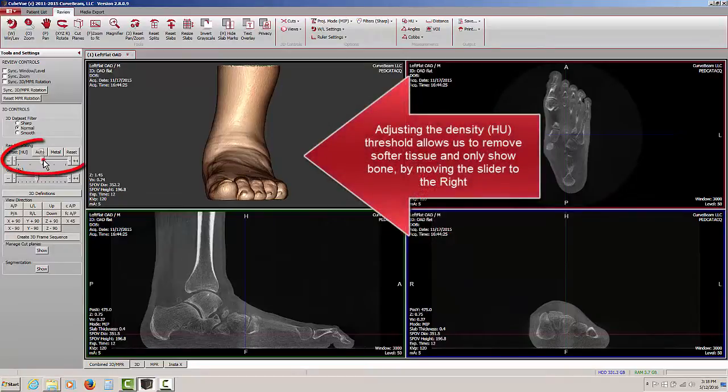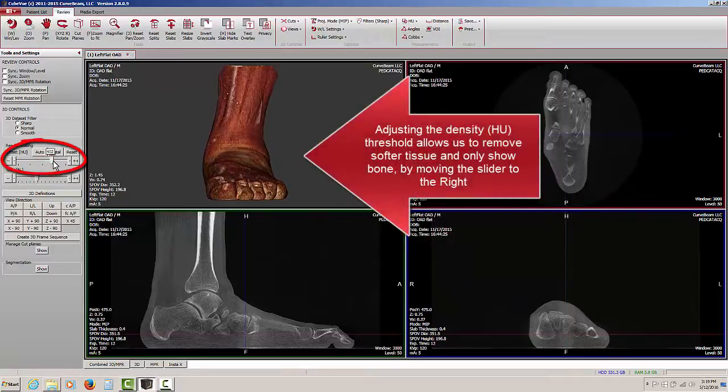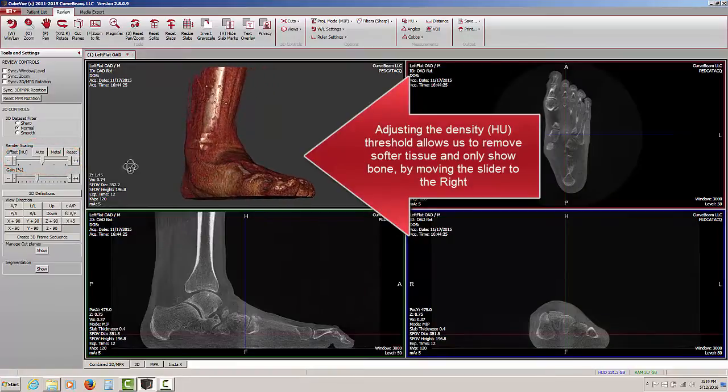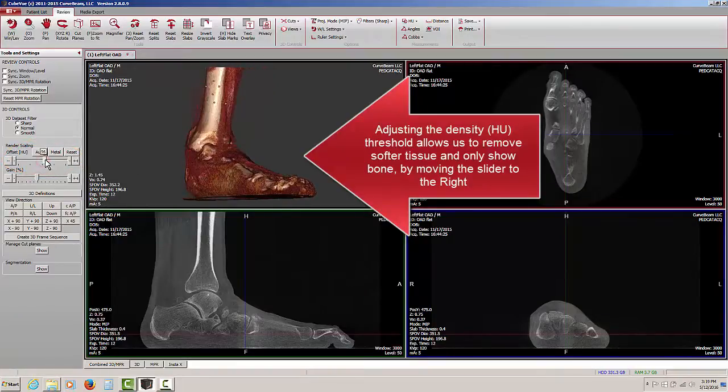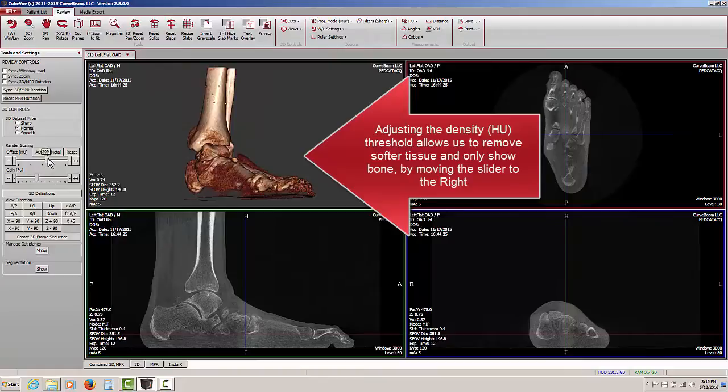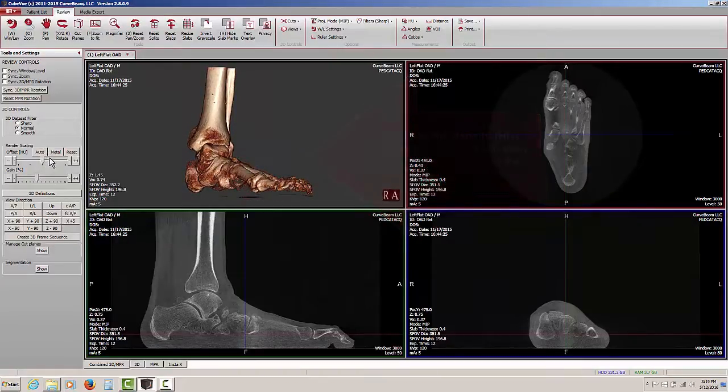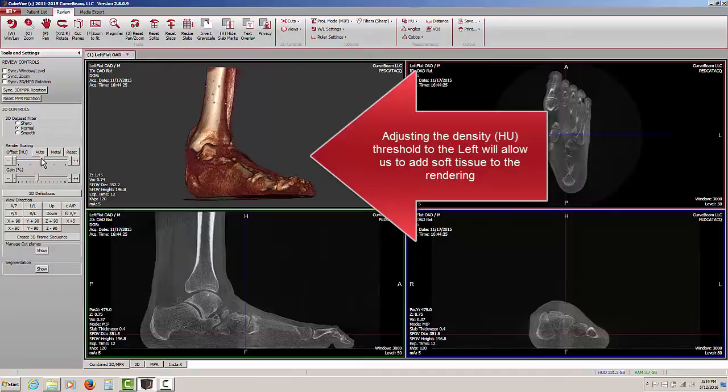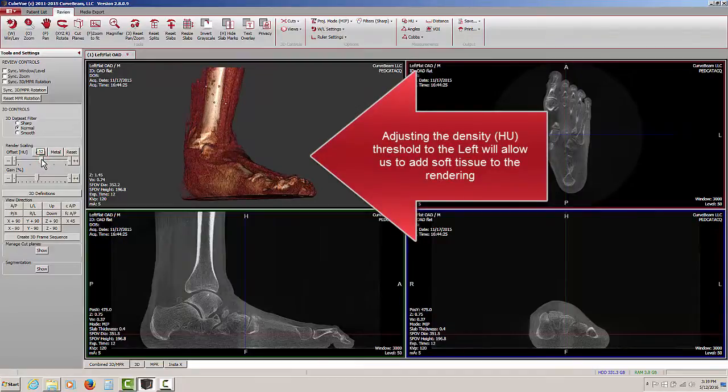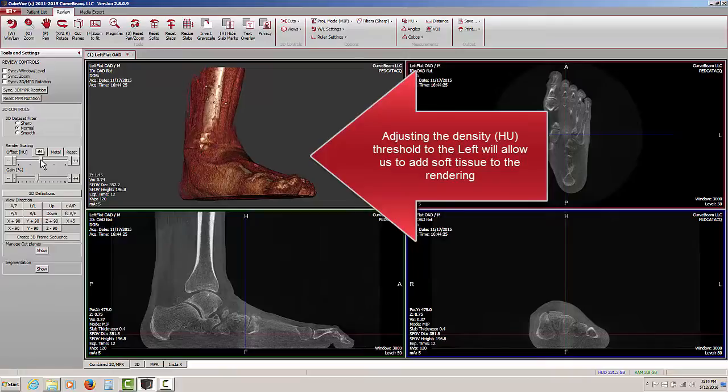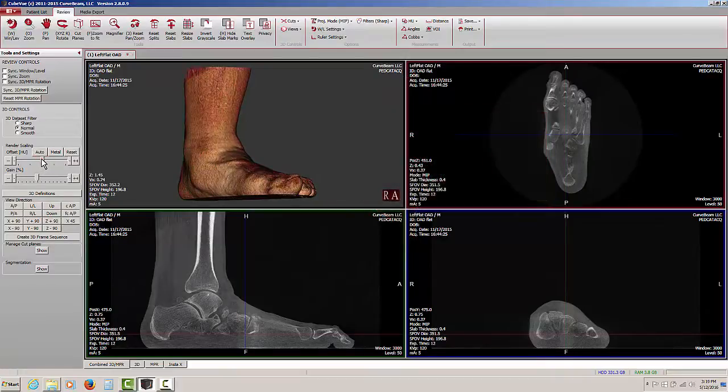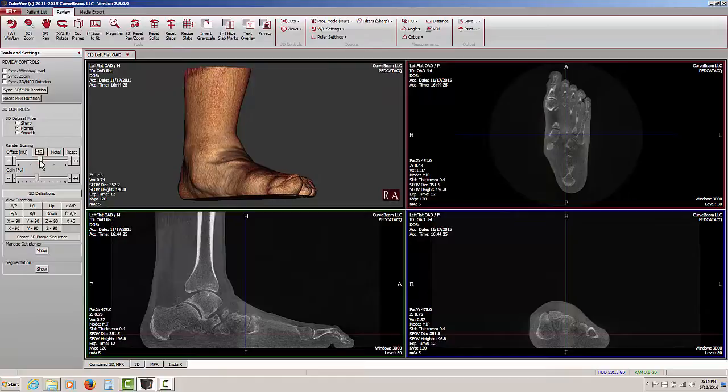By adjusting the slider, we can remove softer tissue, in this case skin, subcutaneous fat, and as we continue to adjust the sliding scale, we are presented with the more dense material. When we adjust in the opposite direction, we are adjusting the threshold at which softer material appears, gradually moving that point lower and lower until finally all of the soft tissue appears.